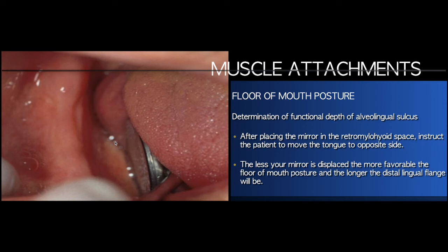instruct the patient to move the tongue to the opposite side. The less your mirror is displaced, the more favorable the floor of the mouth posture, and the longer the distal lingual flange will be located in this particular region.